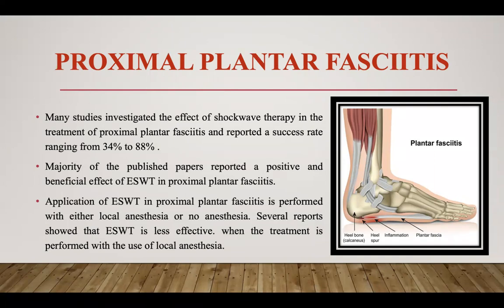The majority of the published papers reported a positive and beneficial effect of extracorporeal shockwave therapy in proximal plantar fasciitis. Application of extracorporeal shockwave in proximal plantar fasciitis is performed with either local anesthesia or no anesthesia.